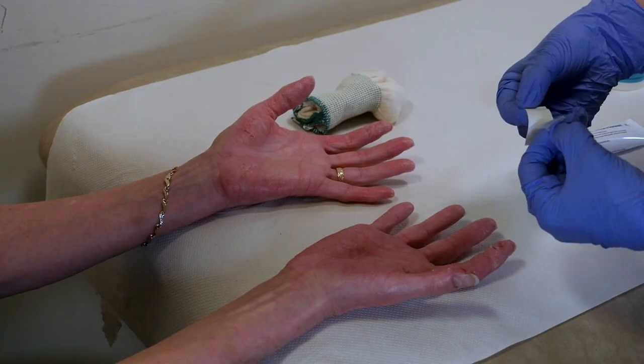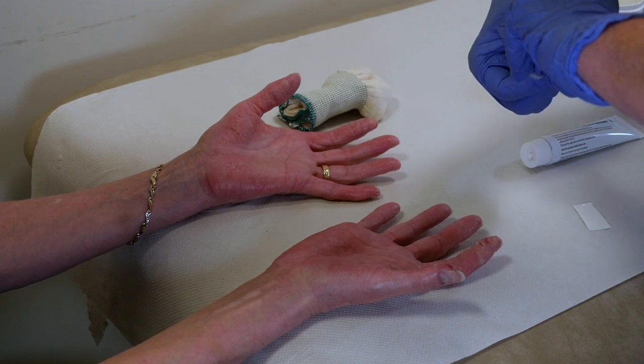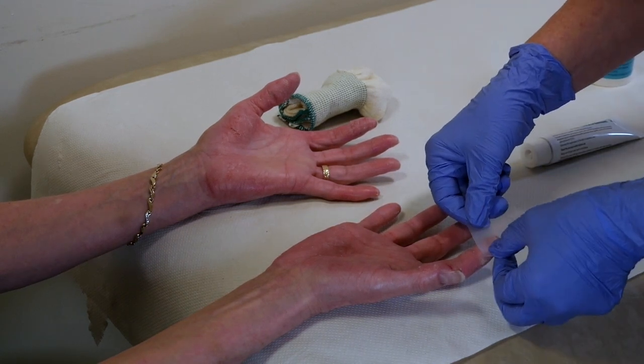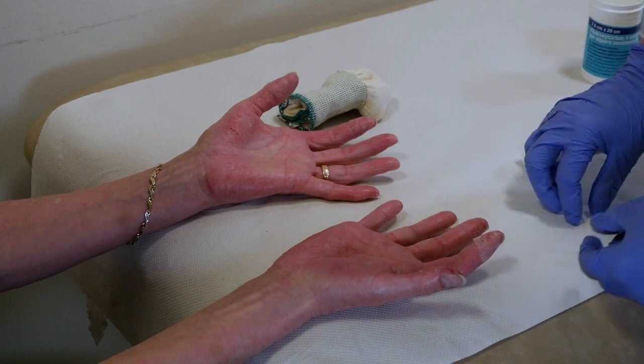Once cut to size, the waxed paper backing can be removed to reveal the steroid impregnated adhesive underneath. The tape is then directly applied over the crack, and its adherence can be aided by gently applying pressure over the tape.